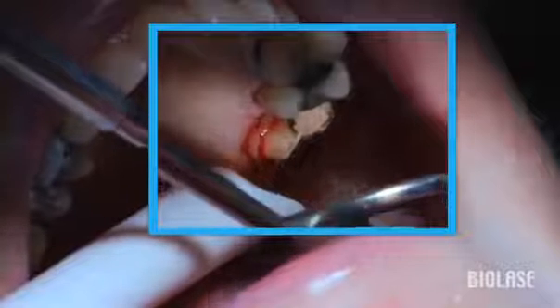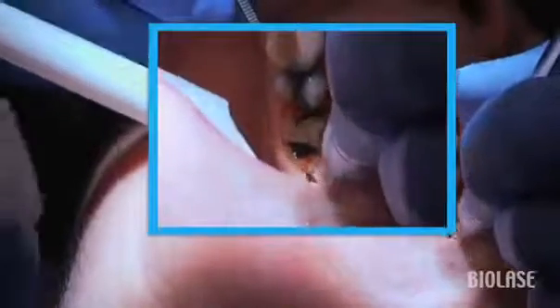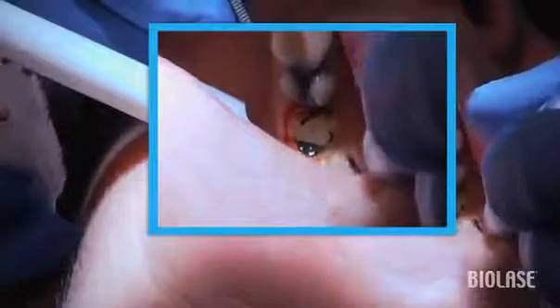I elected to perform a closed flap crown lengthening procedure, which was done very easily with a WaterLase MD hard and soft tissue laser. After preparing the tooth, I was ready to take an image using a CAD/CAM camera, and I wanted to trough the tissue on the mesial, distal, and a little on the facial.